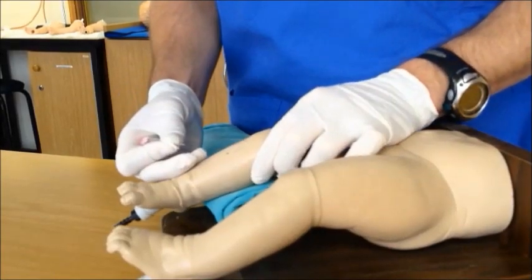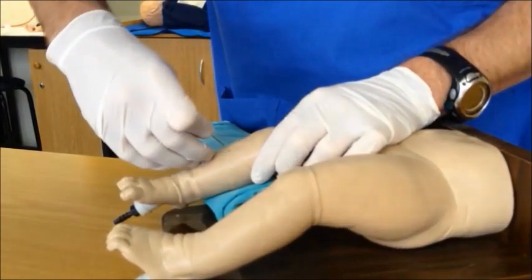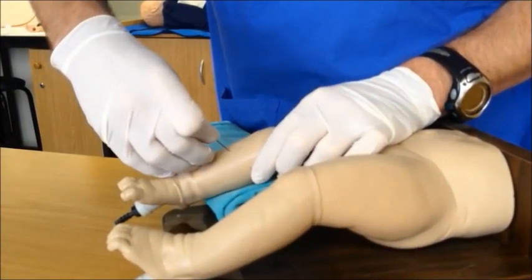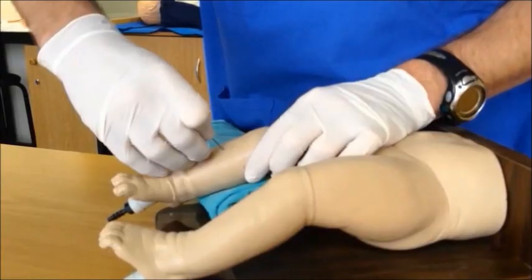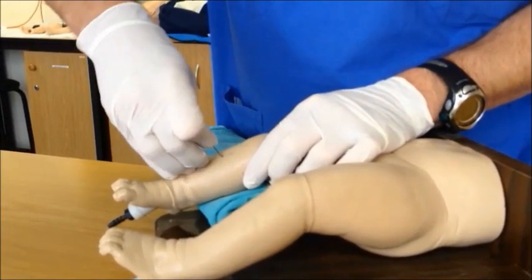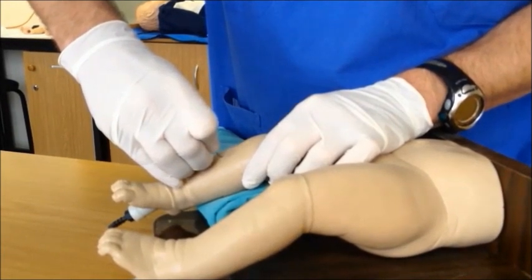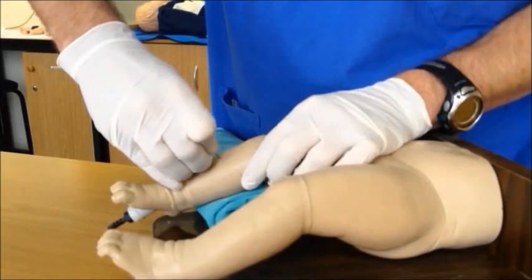Once you have grasped the knee and identified the area for insertion, insert the needle through the skin perpendicular to the skin and bone. Once you have purchase on the cortex, in a firm but controlled manner and in a twisting motion, insert the needle through the cortex — you will feel a give as it goes through. The tip of the needle should now be in the marrow space.